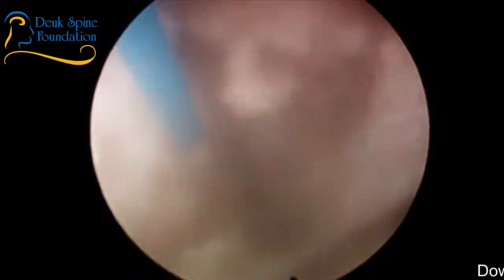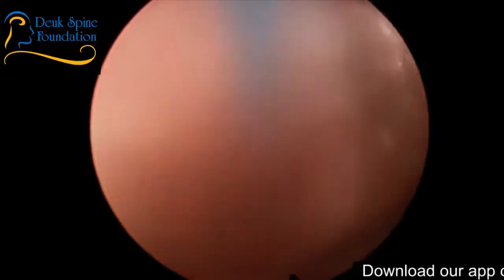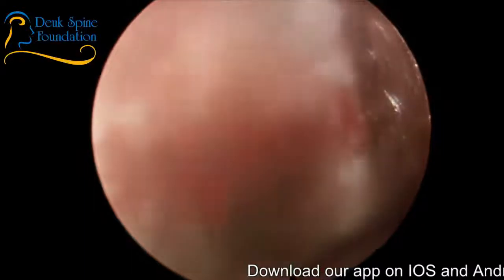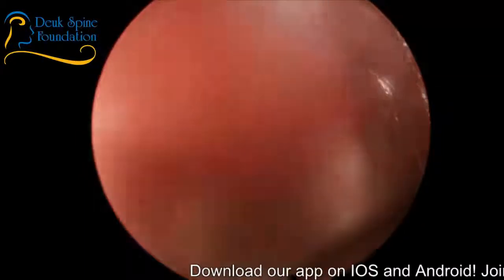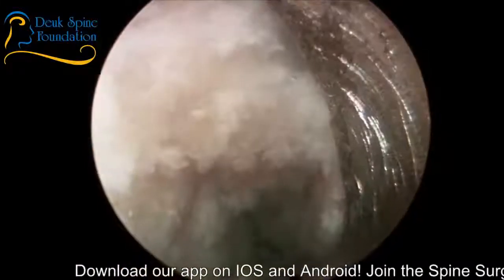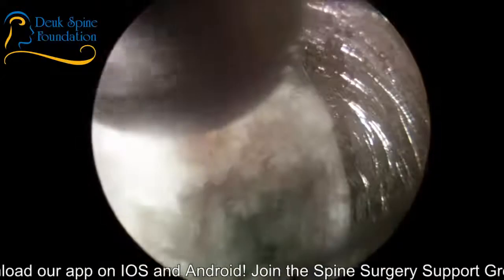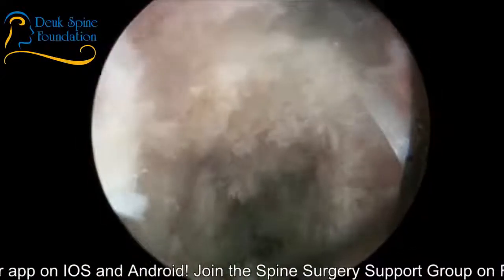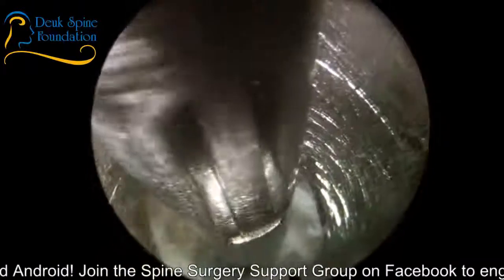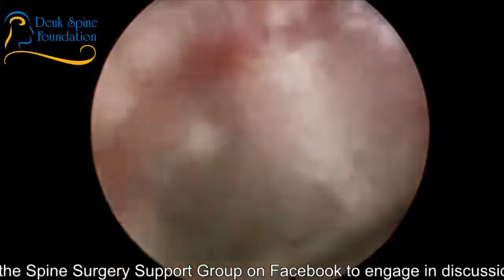How's our BP? All right. Thanks. All right, stand by. We have these little fumaroles down there. Again, there's not a lot of bleeding, but it's enough to be annoying and make it harder for me to see what I'm doing. But that being said, I feel like we've done everything we can do at this disc. Hopefully it's enough.